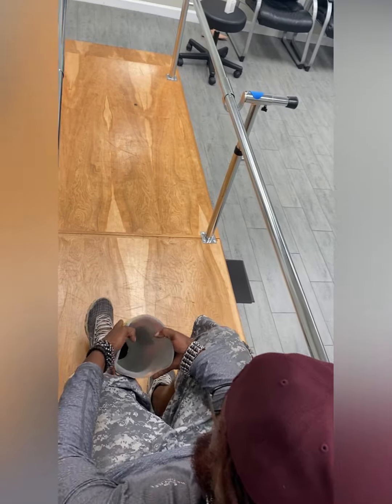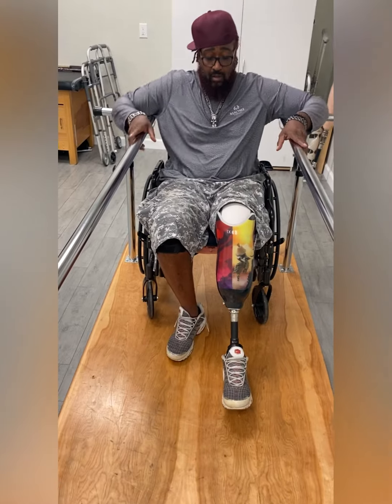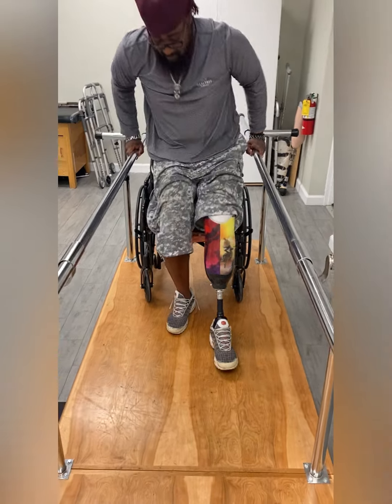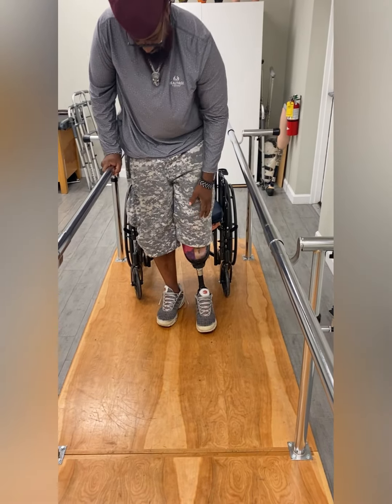Here is another view on how to don your leg. Make sure to hear some clicks before standing up to ensure that the prosthesis is on properly. Next, stand up. You should hear some more clicking as you sink deeper into the prosthesis.